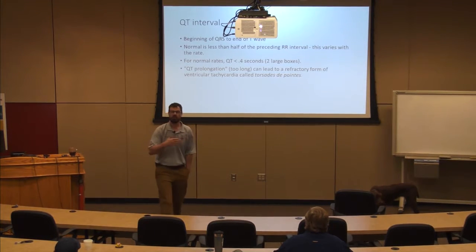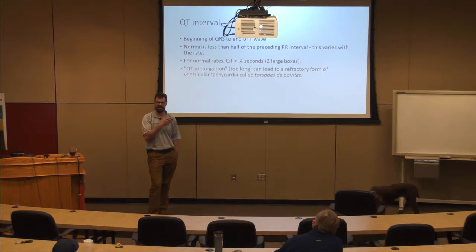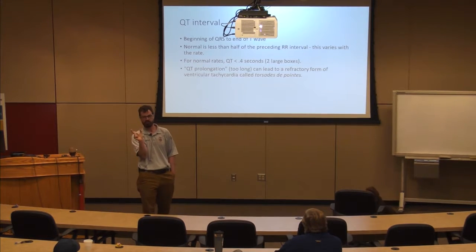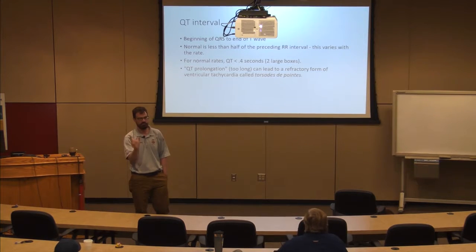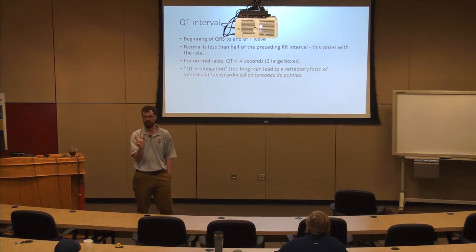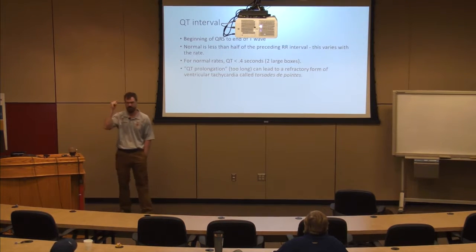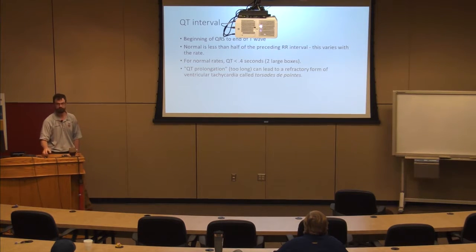So there's not a lot that I can do to treat QT prolongation. But I can say in the back of my mind, this person has a high risk of torsades, particularly when that QT interval gets over 500, okay? That's why I just keep the number 500 milliseconds in my mind, right? So if I have a QT interval that's over 500, I'm anticipating torsades, right?